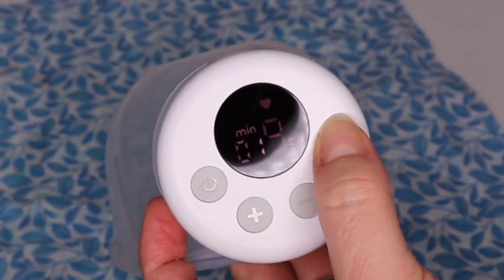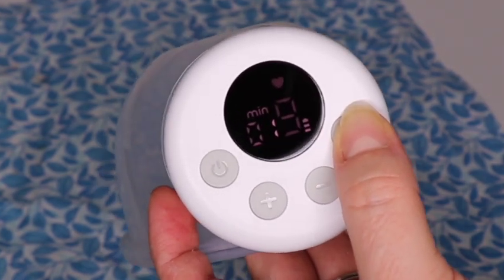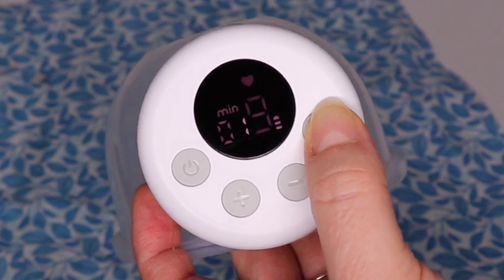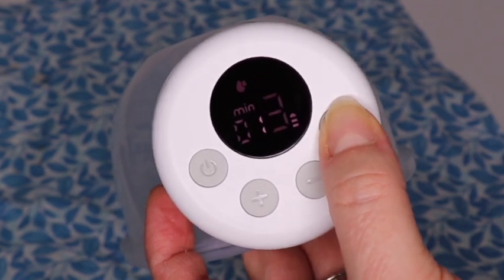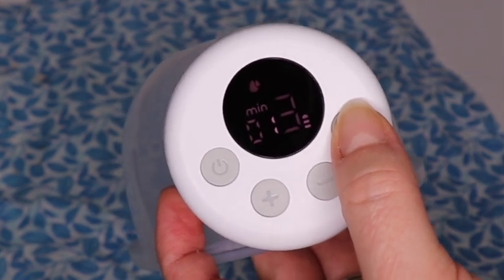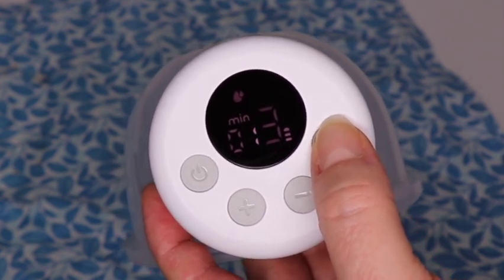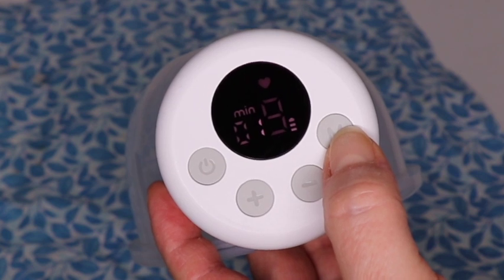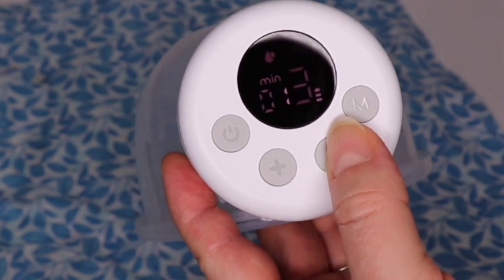There are two modes. Right now we're in letdown mode, which does several lighter sucks and then one stronger suck at the end. I personally don't find that comfortable, so I change modes to suction mode — the expression mode — right away. You'll see little droplets in the top left corner when in expression mode. If you want to go back to letdown phase, you'll see that little heart in the right-hand corner.